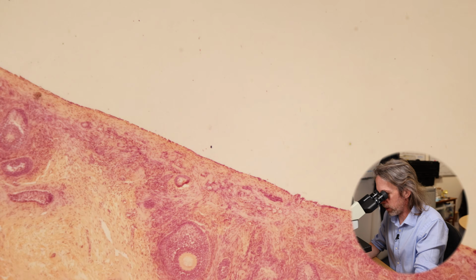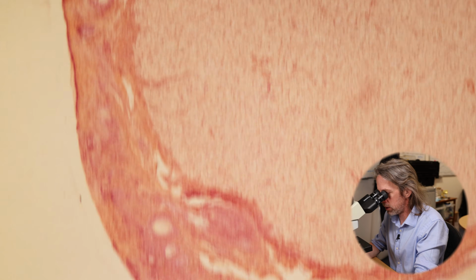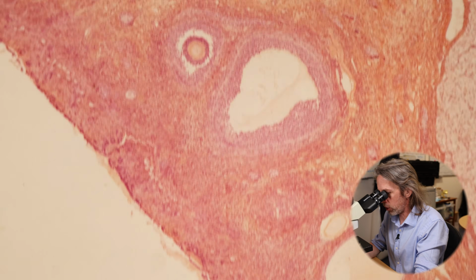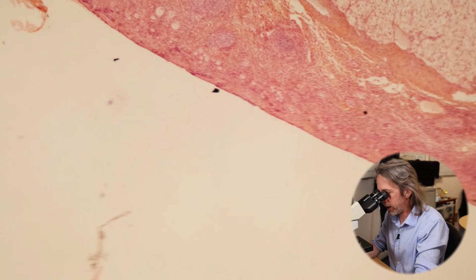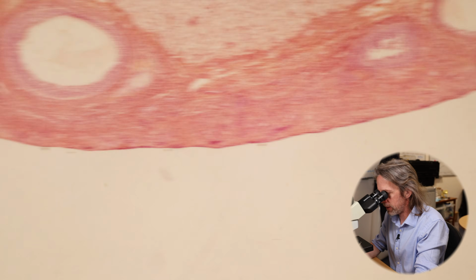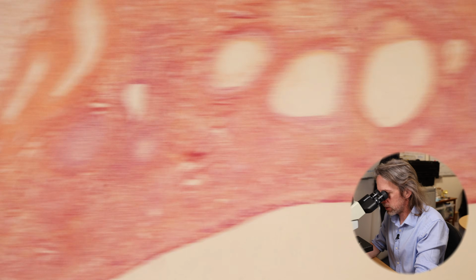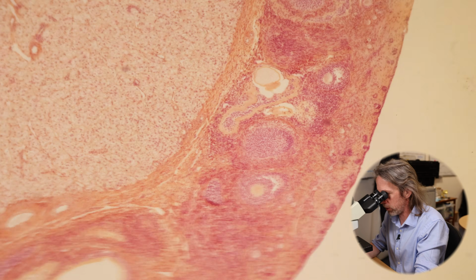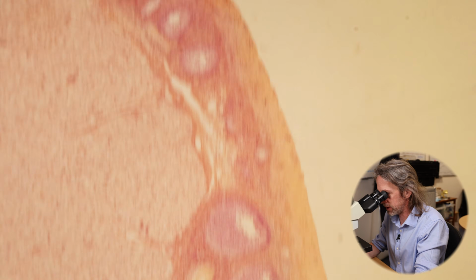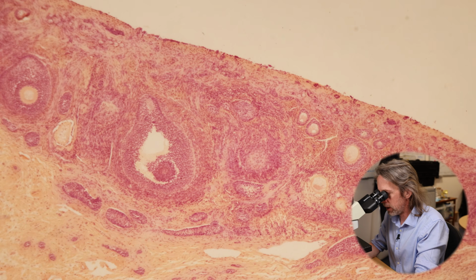That's my lowest power. This is quite a big, this is the whole ovary. Told you, lots of circles. Following the outer edge there. And there's not a great deal of stain here. So what we need to do is identify all of these circles and recognize these patterns. Got a bit of yellow staining, a little bit of purple staining, not a lot of staining.